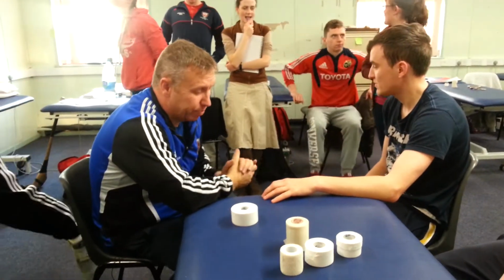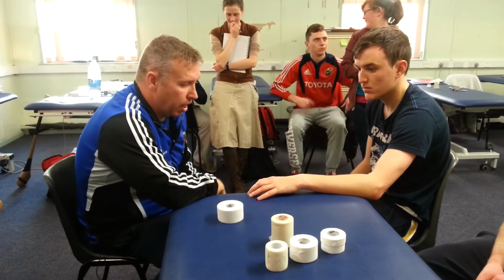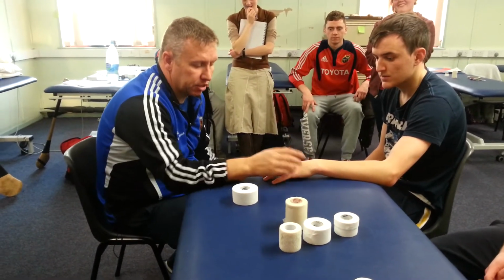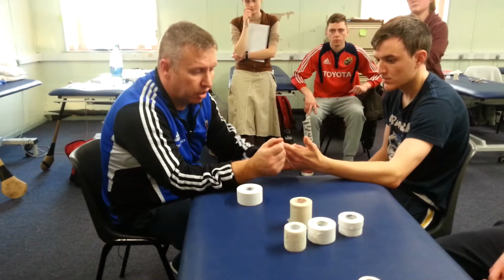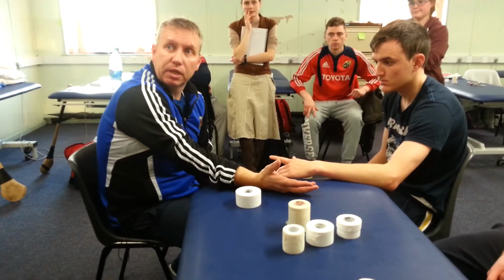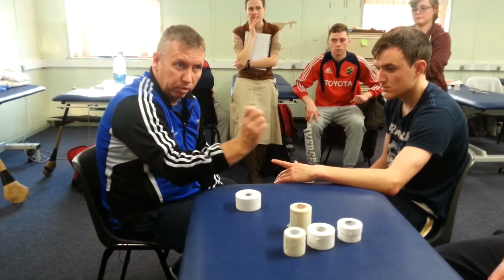There are different ways you can strap the wrist and the thumb. As I said, you'll find different variations. You can do the check rein at the back to stop a person from going into flexion. You can do that for the thumb as well, and for the fingers, just like the elbow and the knee, where you stop the hyperextension. You can put check reins to try and pull that into position.